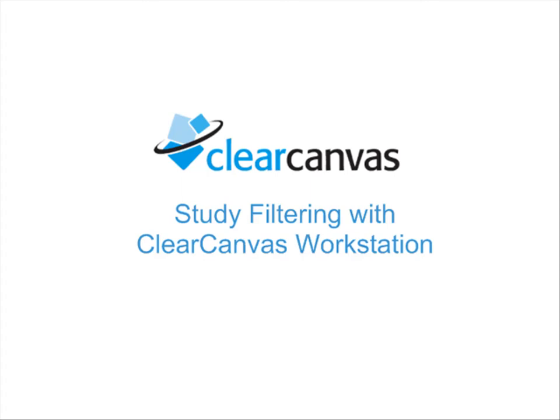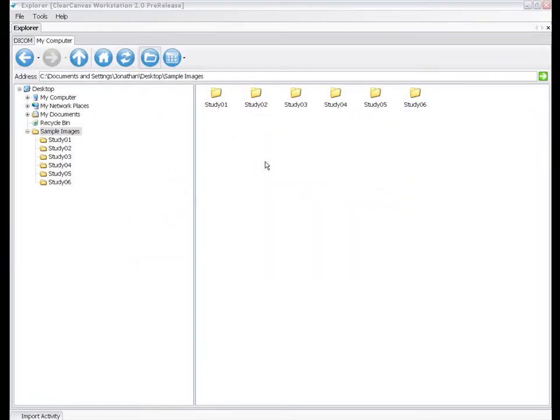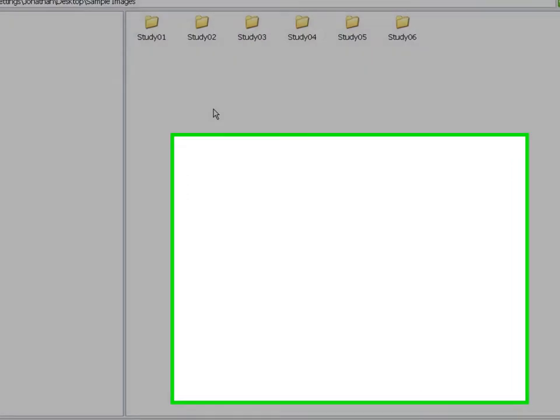Hi, my name is Jonathan and I'm a software developer at ClearCanvas. Today I'm going to introduce the Study Filters feature that's part of the ClearCanvas workstation.